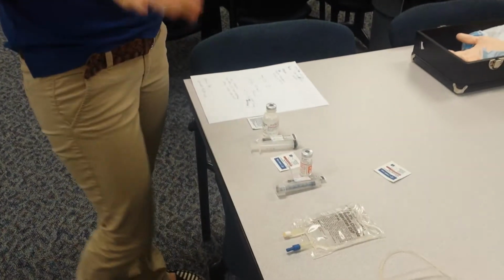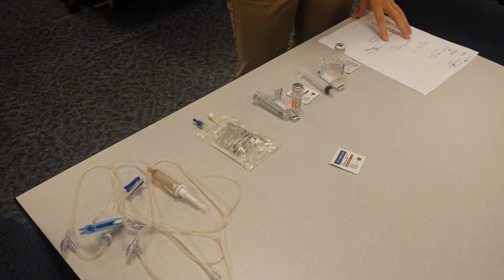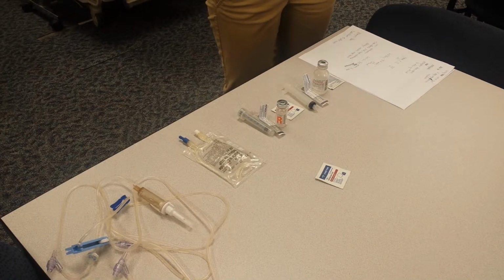We're going to draw up. My vial of vancomycin is 200 milligrams per milliliter, so I'm going to need 2.5 milliliters of that. And we're going to put it in a 50 milliliter bag. So doing our calculation, that would be 8.3 drops a minute and about 1 drop every 8 seconds.